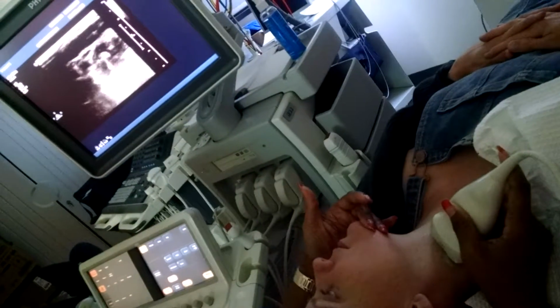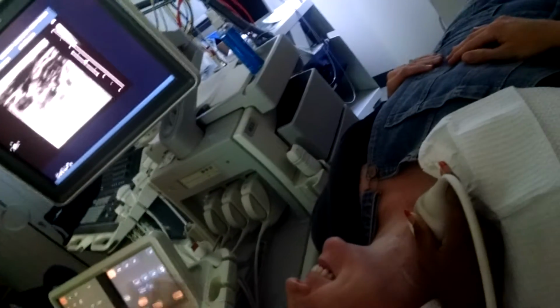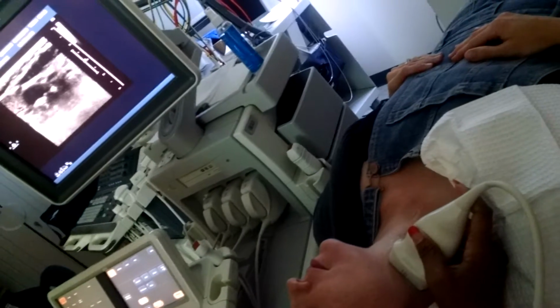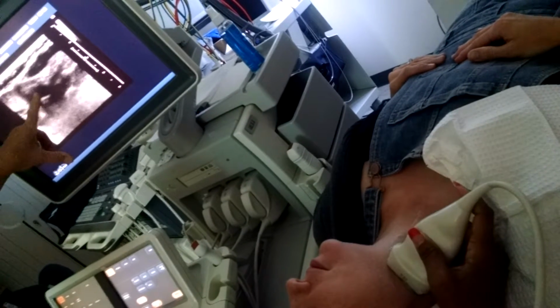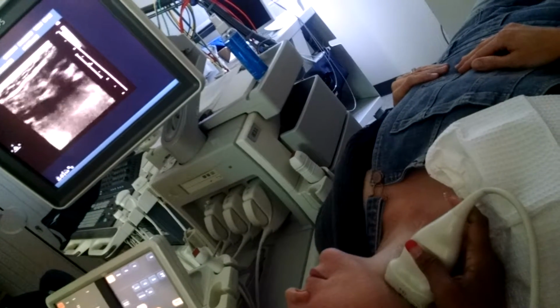Plus, you're kind of straining to see because the sternocleidomastoid muscle is in the way. Right. So there's the bulb and there's the bifurcation. So it's this and this. Correct. And I'm going to go all the way up to the mandible as far as I can, and they disappear. Okay?